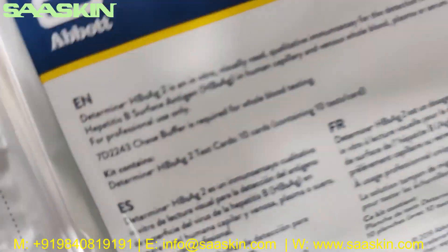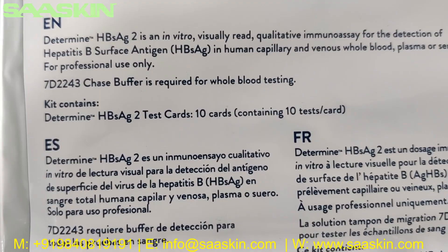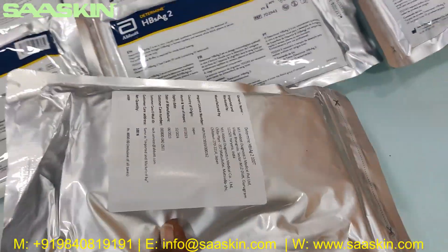This test kit pack contains under test strips. It is 10 cards and each card has 10 tests. This is how the total pack looks like on the other side.